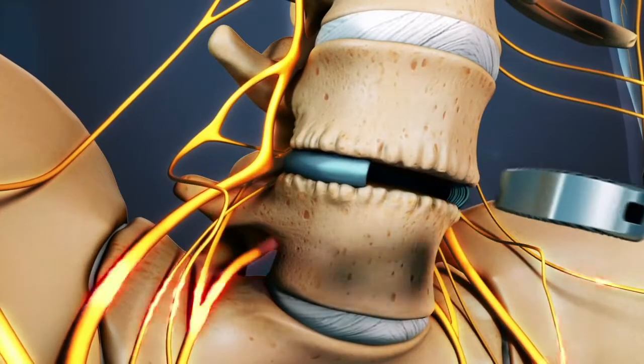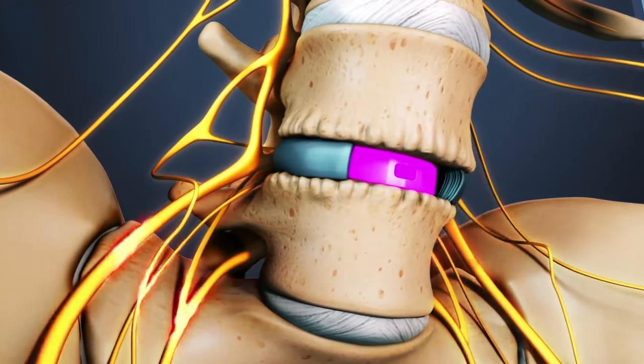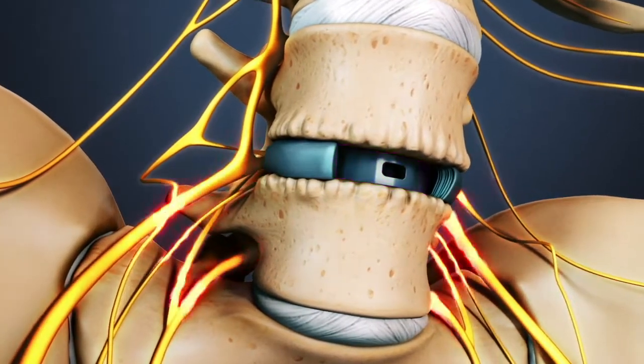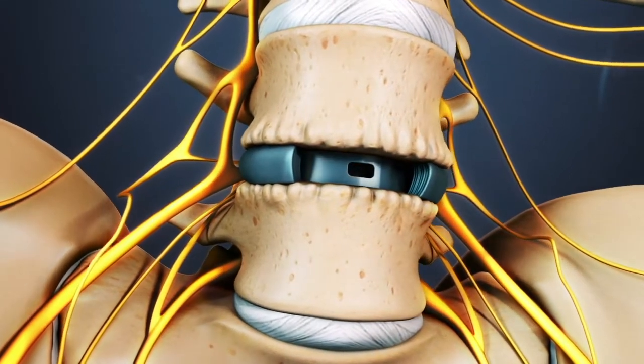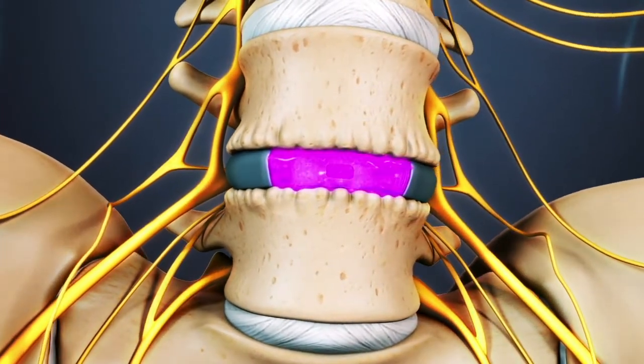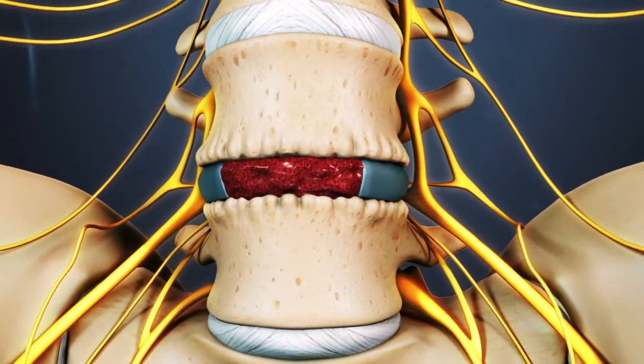Some type of implant, called a cage, is then inserted into the disc space. The cage helps restore more of the normal spacing in between the vertebrae, alleviating pressure on the nerve roots. Bone graft is placed in the cage and sometimes in front of the cage. Sometimes additional fixation is used by inserting screws through the cage.